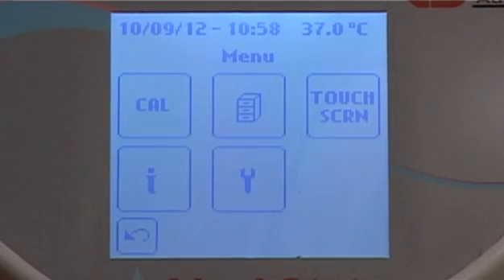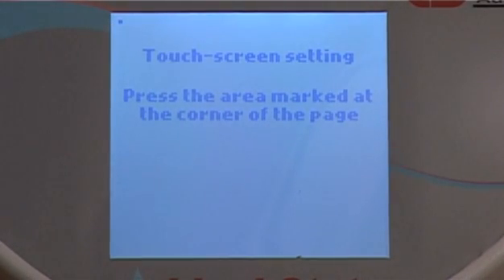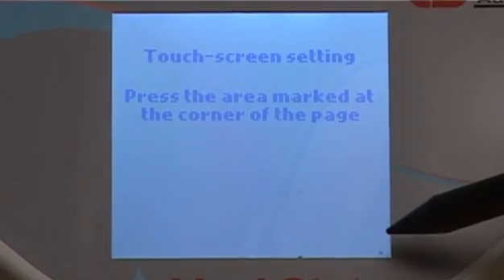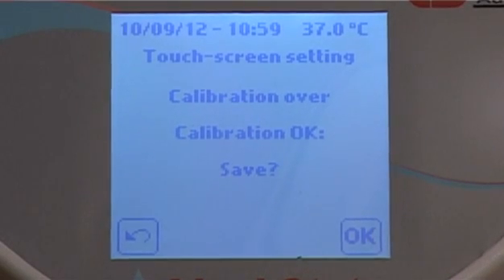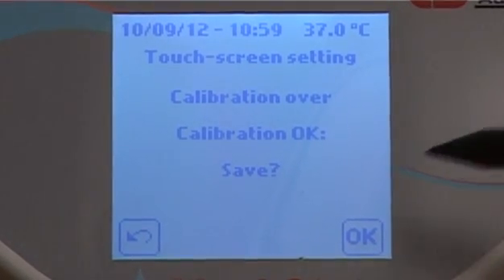To perform a calibration of the touch screen, press the touch screen icon. Press the five black spots on the screen, keeping them pressed until a beep is heard. At the end of the procedure, the software will confirm if the calibration has been completed successfully. Press OK to confirm the calibration.